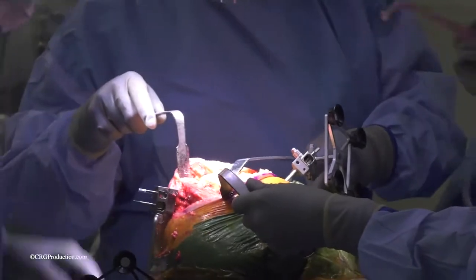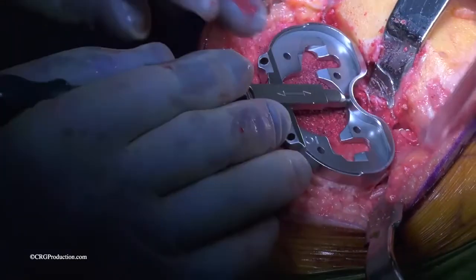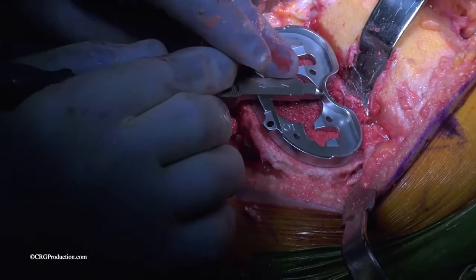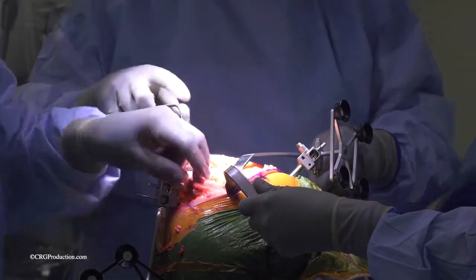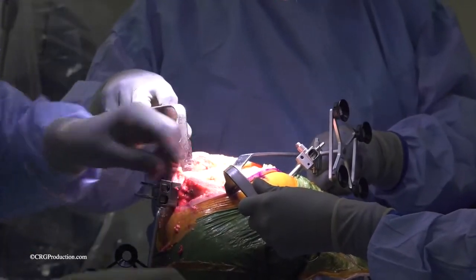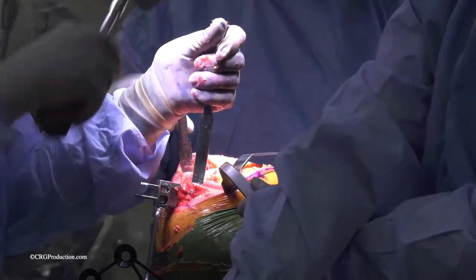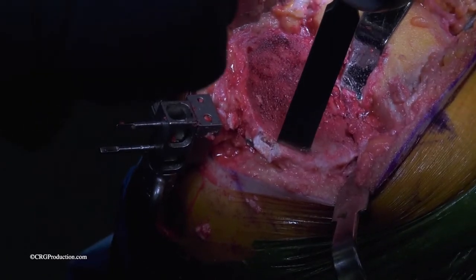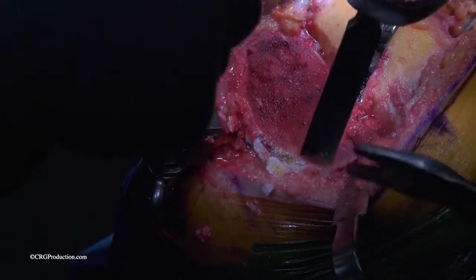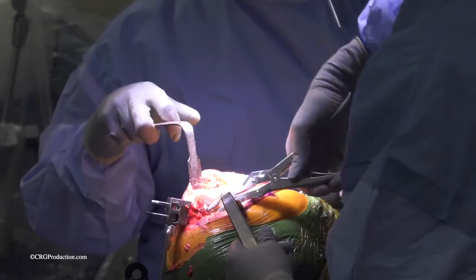So with the two bent Holman retractors in place on the inside and the outside, and the pickle fork in the back, we can see the entire top of the tibia. We're checking the size. As we discussed, we have 8 sizes. The Mako CT scan review does demonstrate what size to use. We like to confirm it in vivo, however. Make sure it's the proper size.